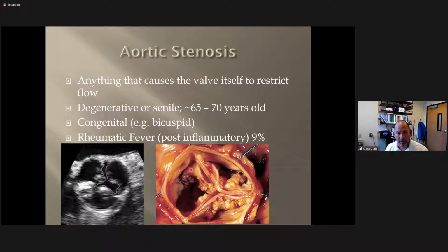Note also that in the current world we live in with 3D printing, with a 3D echo, a 3D CT, or a 3D MRI, they can send those data sets back and get them 3D printed, and they can actually print out an exact replica of that patient's exact plaque burden or congenital disease, and they can use those to help teach patients what's going on with their own heart. They can also tissue type it so that the tensile strength and elasticity of the 3D printing mimics the actual tissue type. And so then they can test out devices and see what's going to work before they have to crack the patient's chest open and do the surgery. So, super cool world. If you like all that techie type of stuff, I do. I think the 3D printing is super cool. We haven't gotten to the point of 3D printing a heart and just replacing it that way, but that is being worked on. So stuff like that is being done.